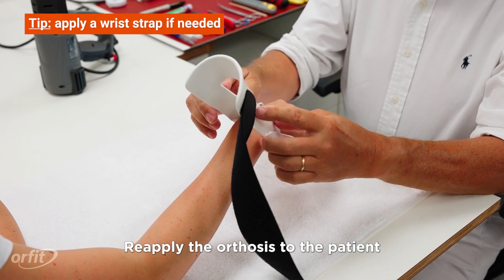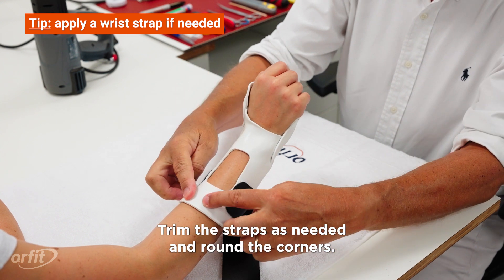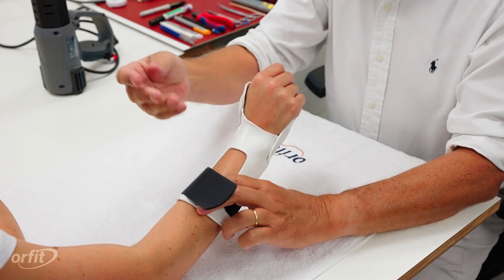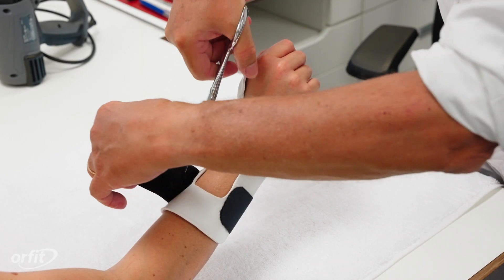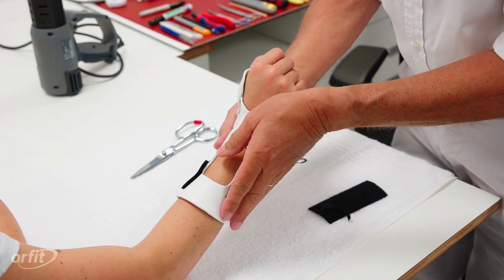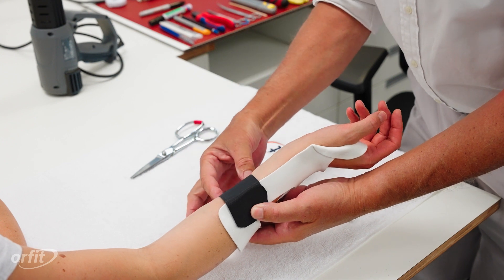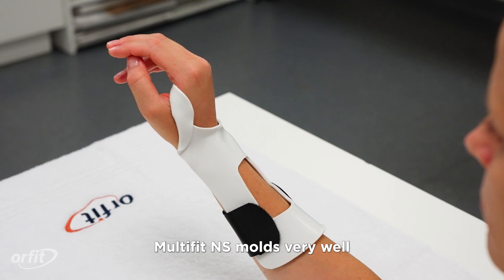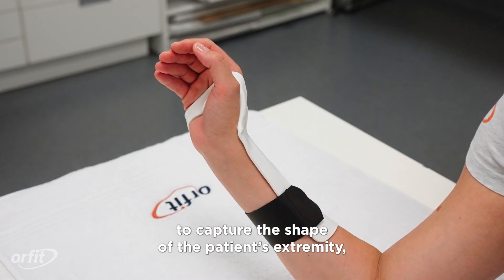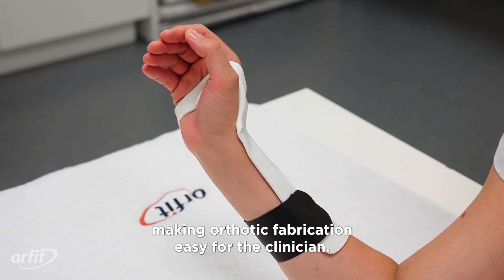Reapply the orthosis to the patient to check the fit. Trim the straps as needed and round the corners. Multifit NS molds very well to capture the shape of the patient's extremity, making orthotic fabrication easy for the clinician.